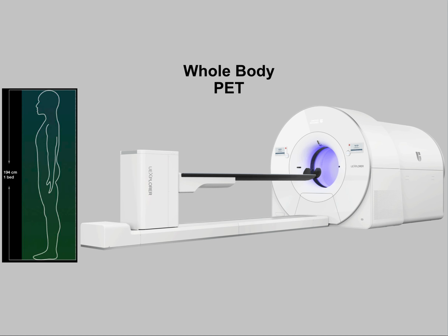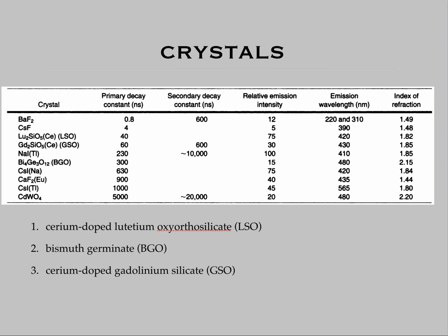What they say is that you can actually get the entire scan in about 3 minutes, which is extraordinary, or do a continuous scan to allow truly fully quantitative imaging. This technology is extremely, extremely exciting, so I can't wait to see some publications and research based on these machines.